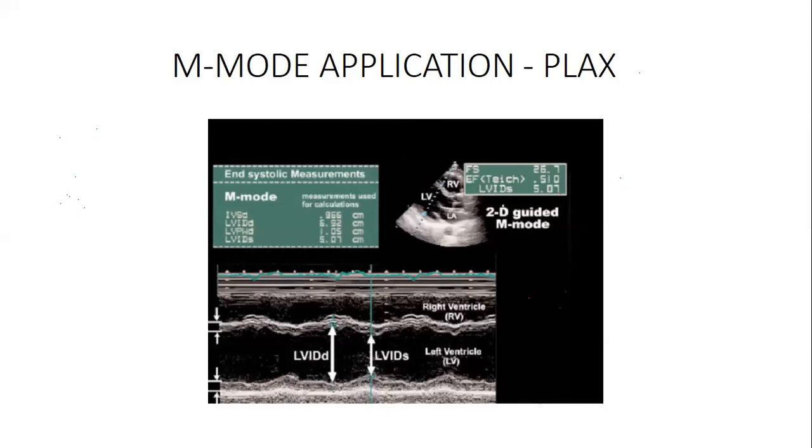Okay? And it goes on down there. So this is the depiction of that. Where is the right ventricle? In fact, they have even labeled here now, right ventricle. Okay? Now, look at this.